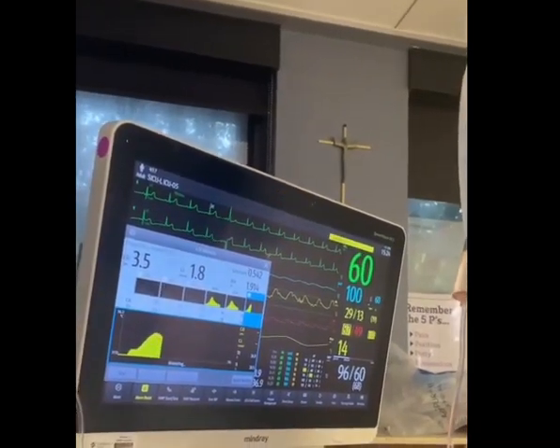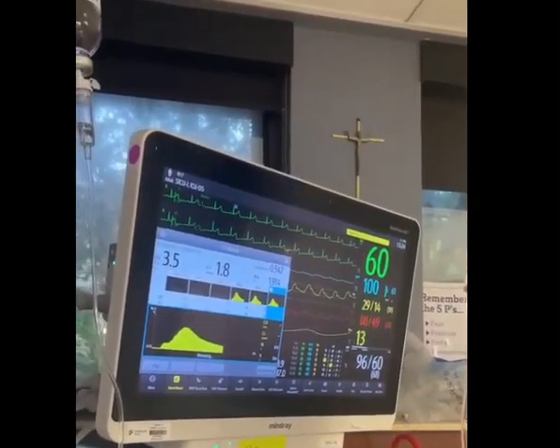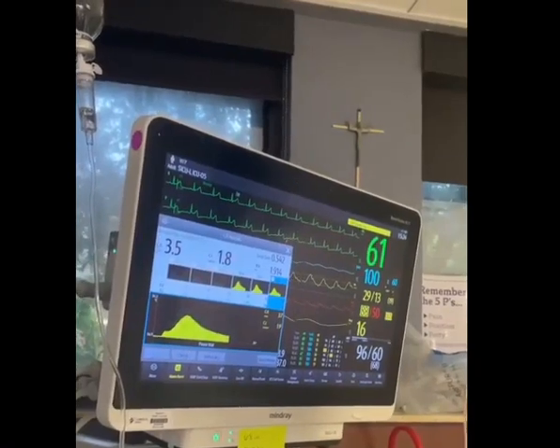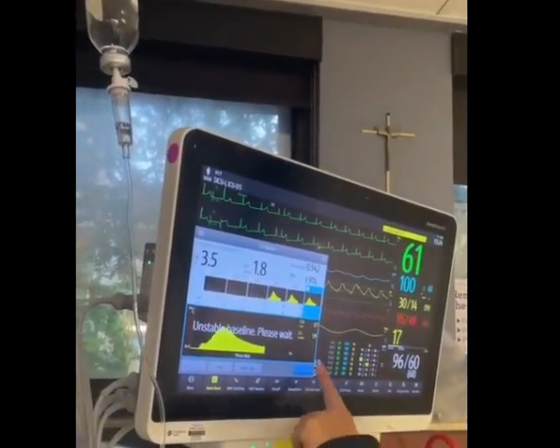Now for the wedge pressure, we're going to use the PA diastolic. So if you look over there, it's about 13, 14. I think I ended up using 14 for this. So you'll need your CVP and your PA diastolic, which is our wedge pressure, to enter those to be able to get all of your hemodynamic values.